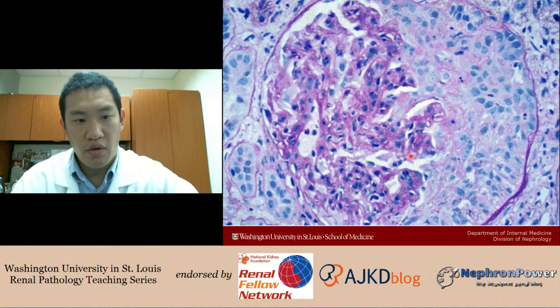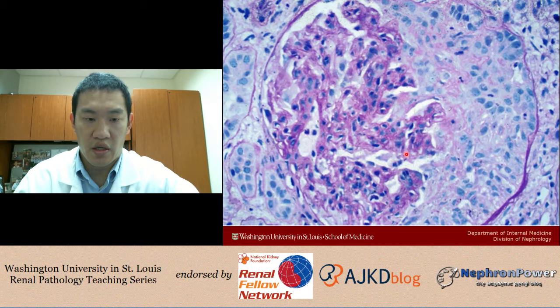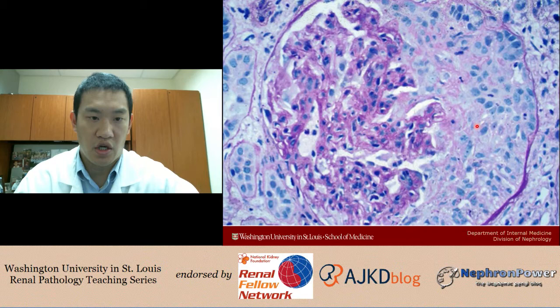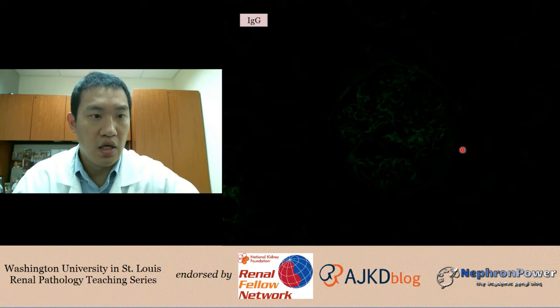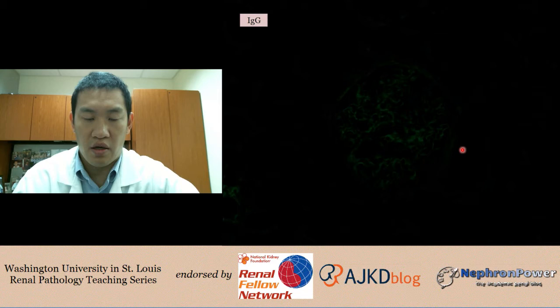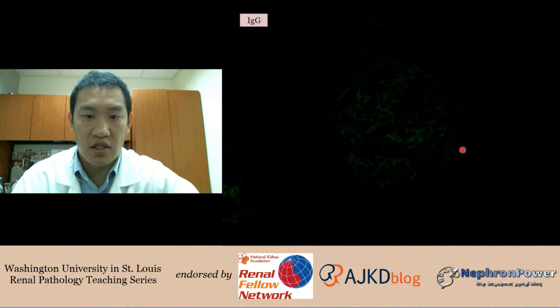So why is this important? Let's say you had this finding on the kidney biopsy — which is quite possible for the case I presented. What we see here is a large cellular crescent, which is leading to destruction of this entire glomerulus within space. On immunofluorescence, let's assume it is negative — this is commonly seen and would also be seen in the vasculitides. Although it would be unusual to have a normal serum creatinine, you could have more than 50% of the glomeruli sampled involved, which would put this patient into a 4SA — a class 4, segmental, active lesion.